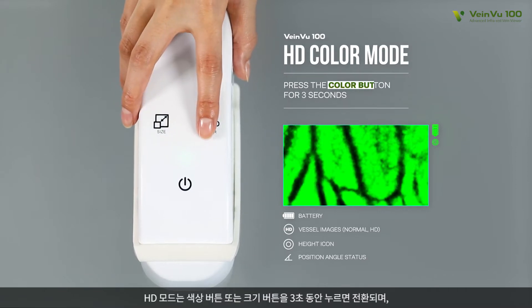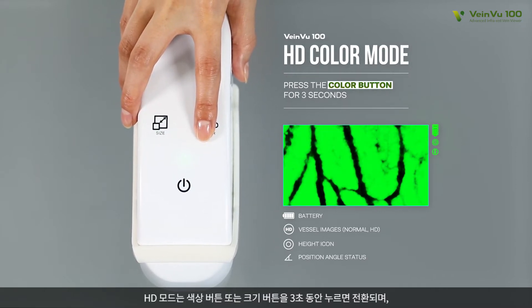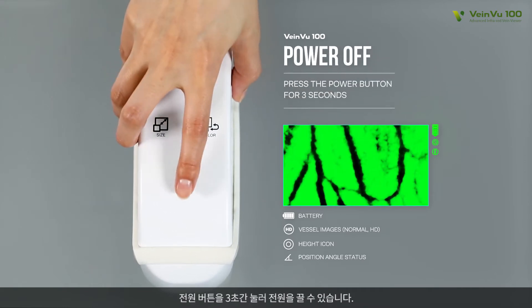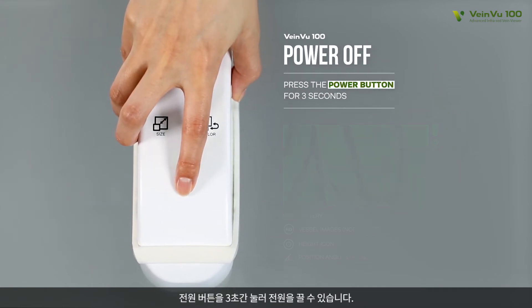To change to HD mode, push the color button or size button for three seconds. This mode is appropriate to observe veins of young children or detailed facial veins. To power off, push the power button for three seconds.